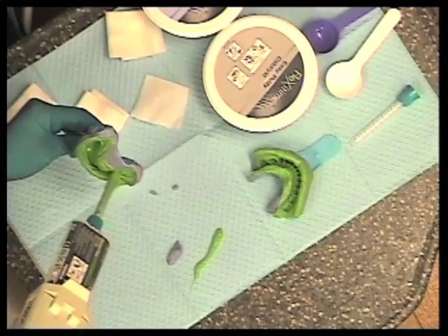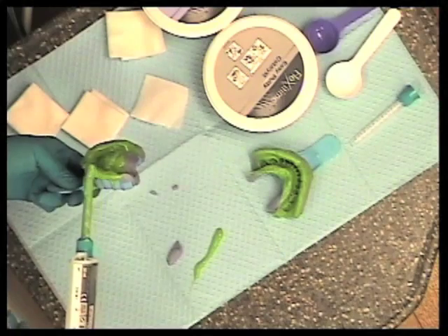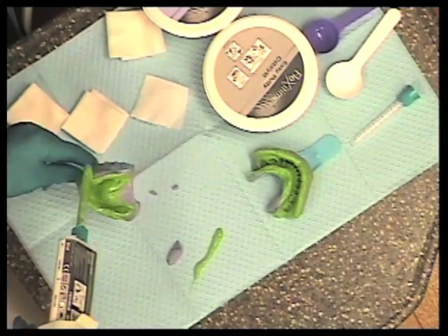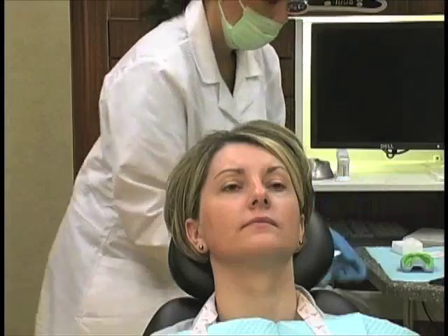Again, make sure you get a little bit up so you get some flow up into the vestibule there. And then we can go back to the patient's mouth. And then you're going to seat this just like you would any impression.